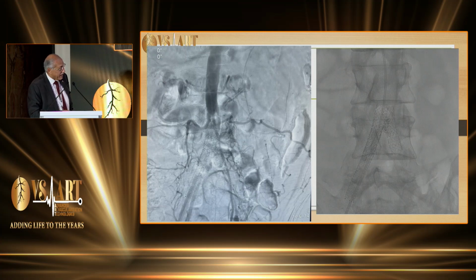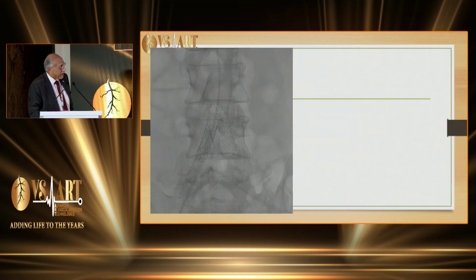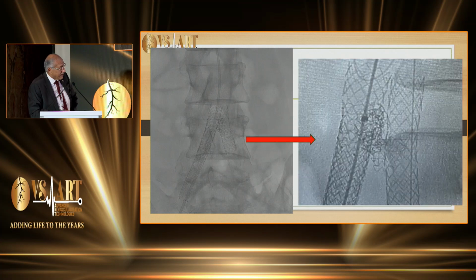These are the angio occluded stents, as you see. But when we had a closer look, we found that there is something in between the stents which we didn't know what it was, but it looks like a crushed stent. So we guessed that the previous operator was not happy about it, so he crushed the stent or something like that and put another stent.